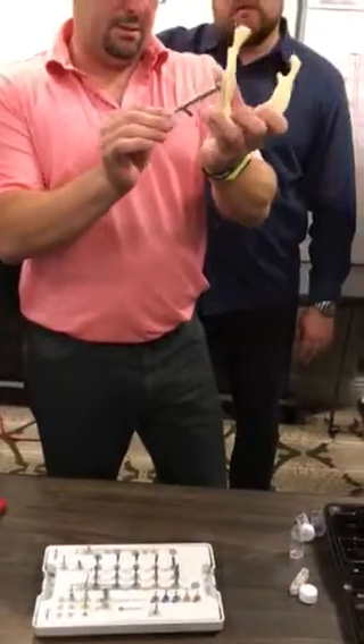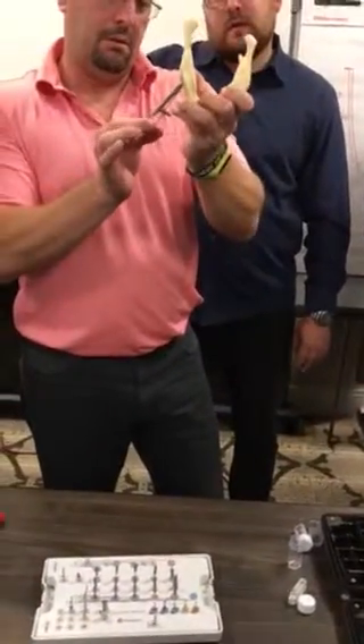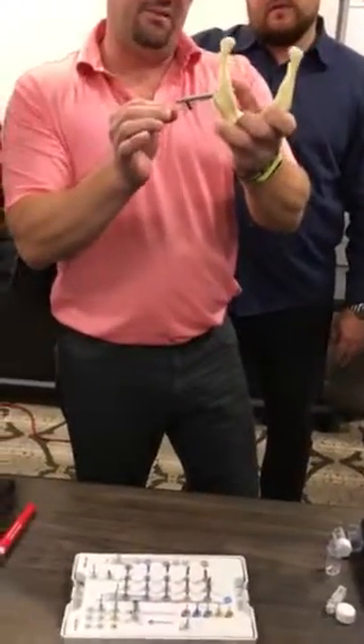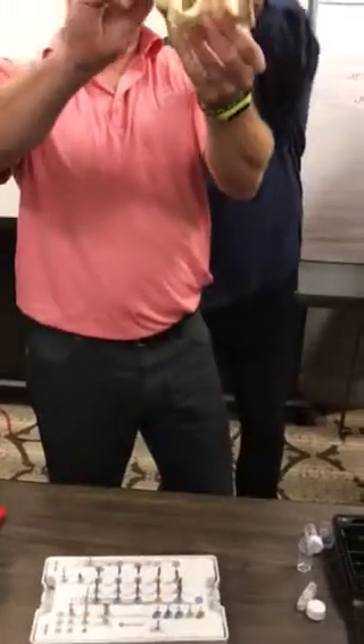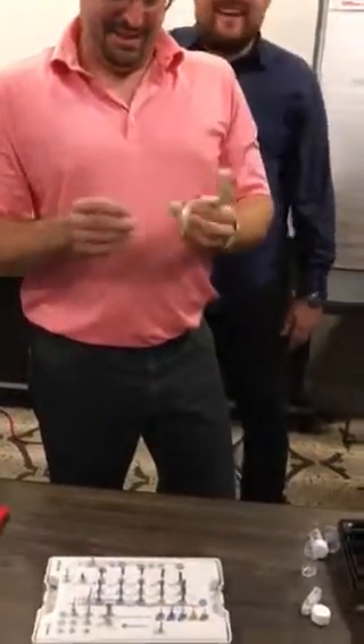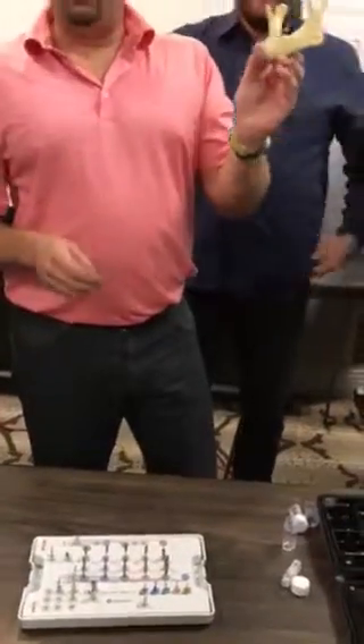You're not at 30 again, I'm at 32. You can keep going — 45. Let's stop at 45. Is that fair? I thought I'd stop at this. You're holding it all wrong — that's why the stop's there. So that's at 45.